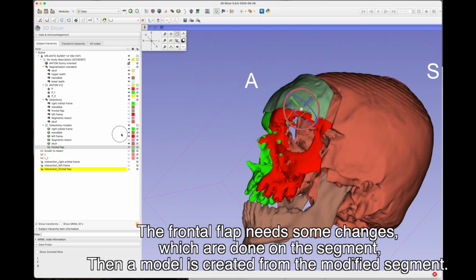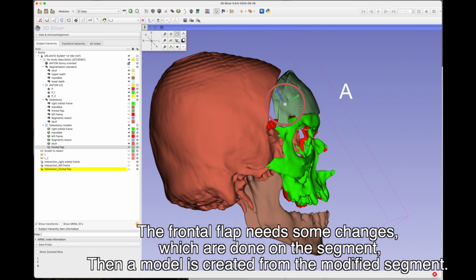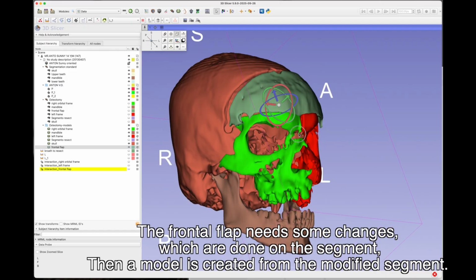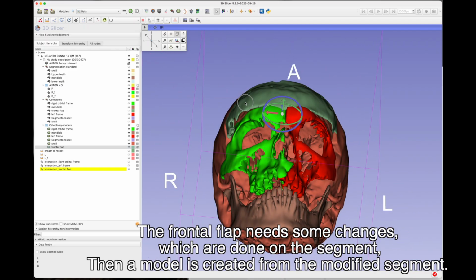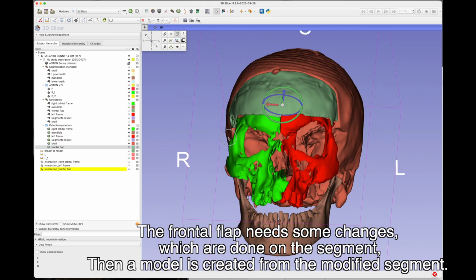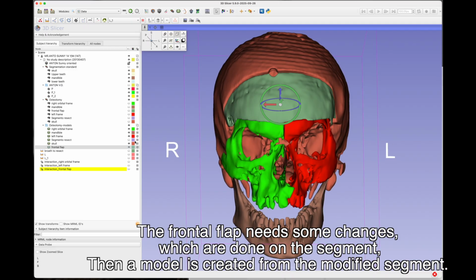Thanks to the malleability of the bone in this patient, the lateral discrepancy between the bone flap and the frontal bone flap will be corrected simply by an osteosynthesis, and it's sufficiently malleable to push a little, to rotate a little this bone and to correct this problem.